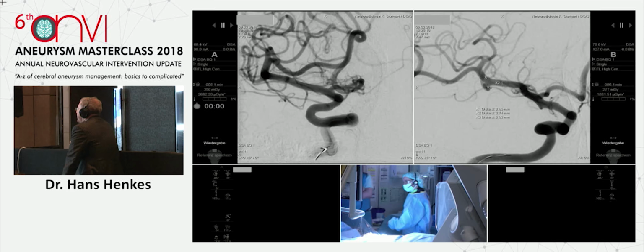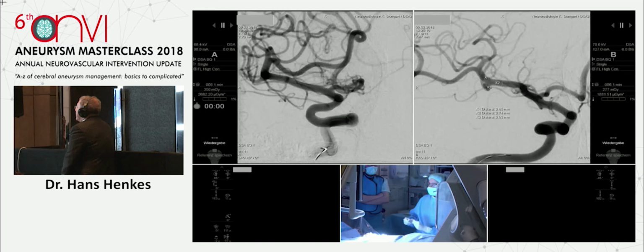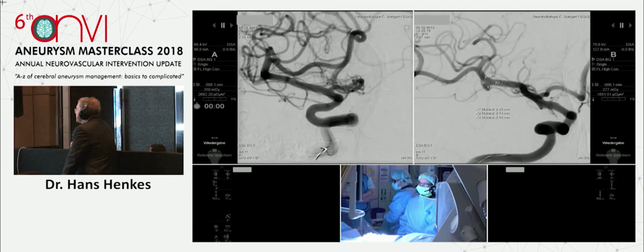Okay. So the argument for 3 is that she expects a better result. Her argument is that despite the fact that the 2.5 millimeter implant would go up to 2.75 physically, it could be just a little too small, too thin, and it's certainly better. I fully agree. It's certainly better to use a 3 millimeter device for this case.